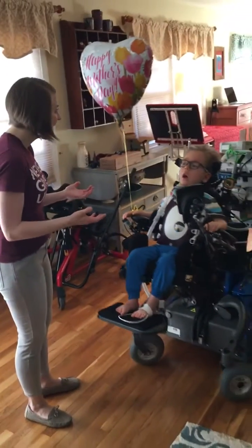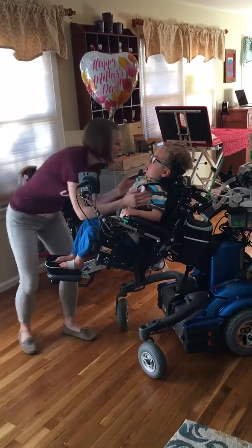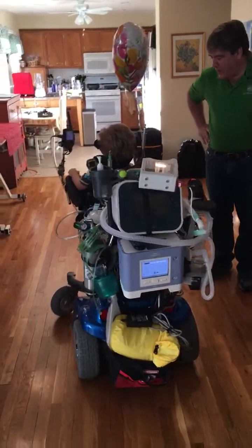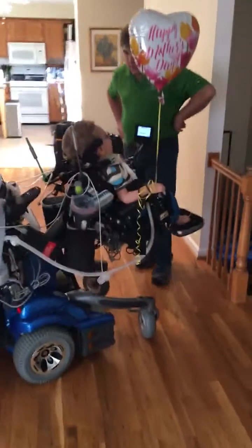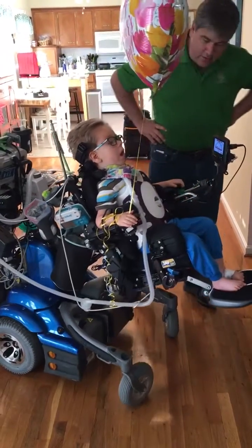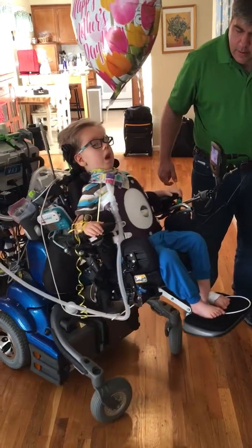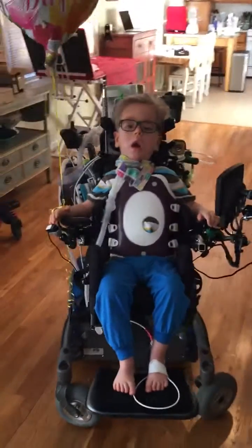There you go. Look at that. Now stop, stop — let go. There you go. Beautiful. Come over to me. Thank you. Wow. You're going to go all the way around, or are you stuck, buddy? All the way around? There's more than one way. Lift your right hand when you're... Almost. Keep going. There you go. Hold it down — you got it. You can hold it down to keep turning towards dad. There you go. Hey, super stuck. Hey. That's awesome. That's perfect.